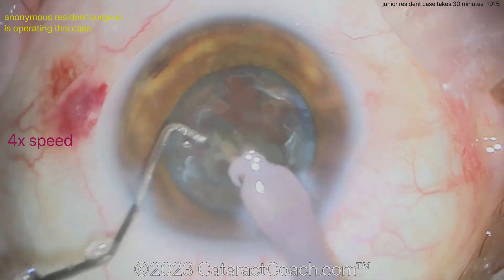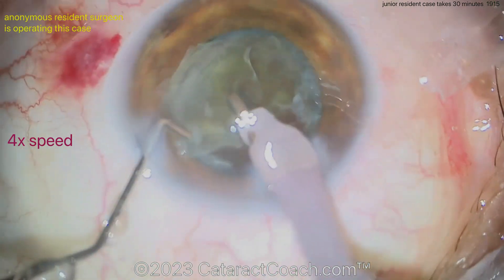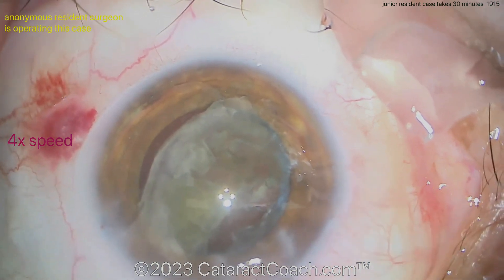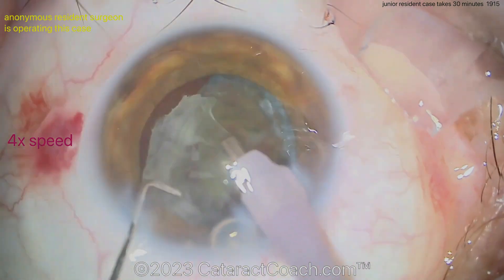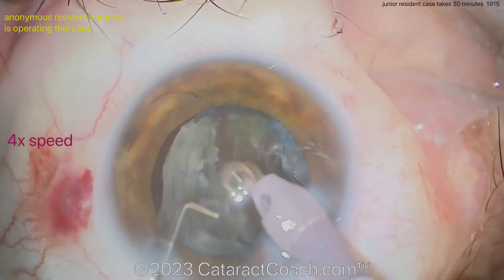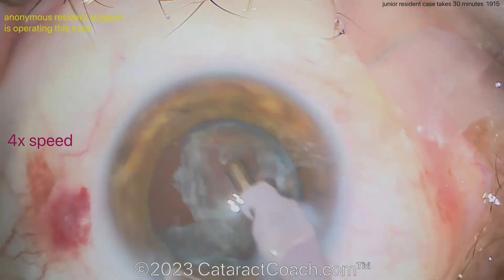Bringing the pieces up — I like the type of lens here too. Not too dense, which is good. You don't want to be doing a dense cataract when you're just starting off as a junior resident in training. Now bringing the whole nuclear piece up. More viscoelastic is added — viscoelastic is cheaper than vitreous. I like the idea of putting viscoelastic behind it to protect the capsule bag. It can be emulsified pretty easily. Great job taking these pieces out — for a junior resident with 10 to 30 cases, this is a fantastic result.